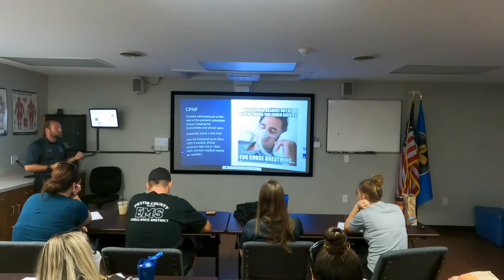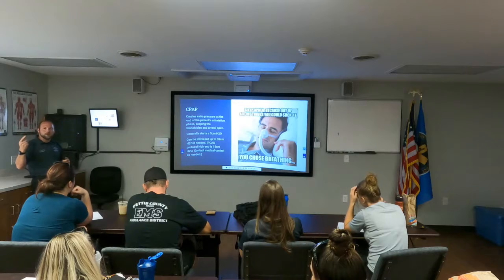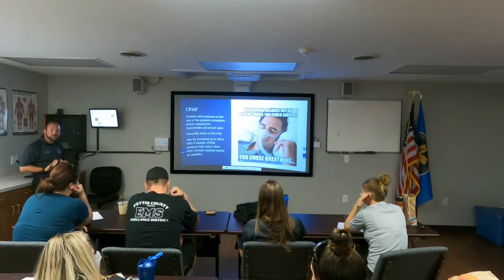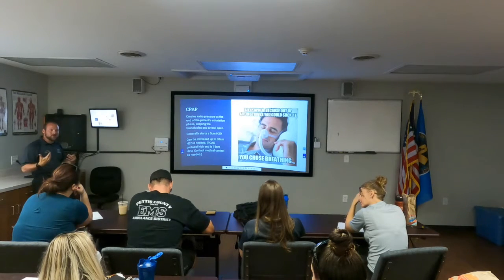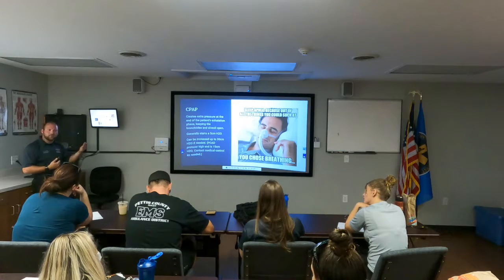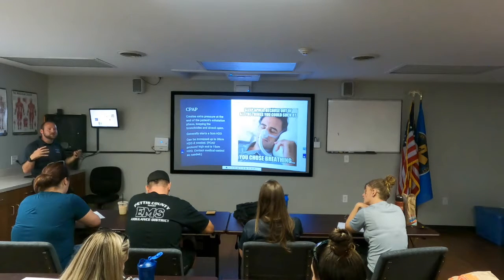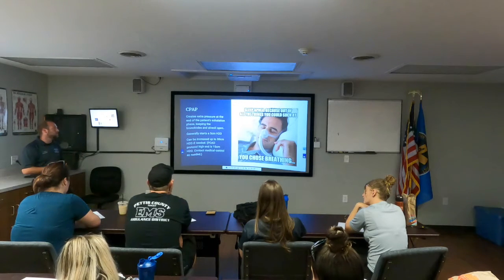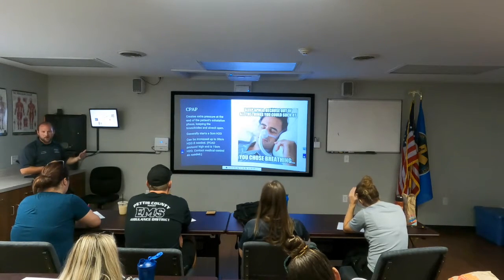Some of the problems you can run into with really high PEEP: try to remember the idea that PEEP is deep. So the higher our PEEP, the greater intrathoracic pressure we have. So you've got pressure pushing against the lungs and against the chest wall cavity that are working against each other. If you have too high of a PEEP, your heart rate will increase and your blood pressure is going to start dropping because the heart has nowhere to squeeze because of the pressure around it to allow it to do its job. So always be concerned about that when you start hitting those higher levels, like 15 or higher.